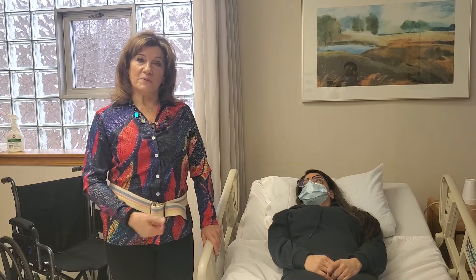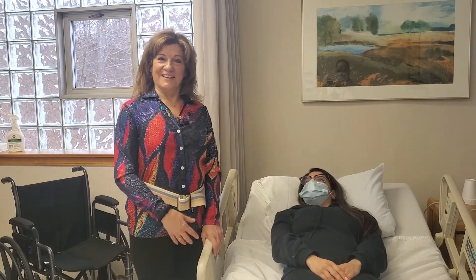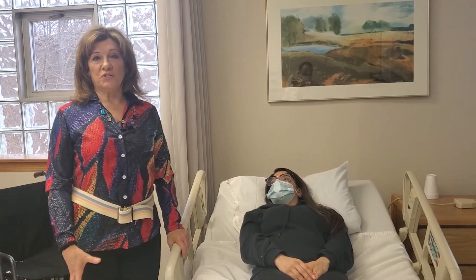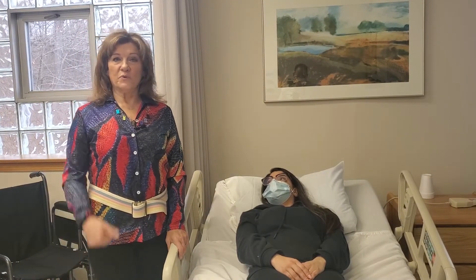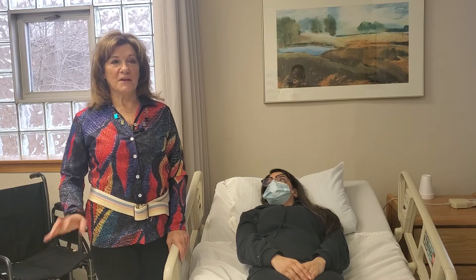We're going to be working with Cassandra — say hi, Cassandra — my sidekick here, and we're going to be getting her out of bed. Make sure you wash your hands before you start and always talk to the person. Tell them what you're going to do, ask them how they're feeling, and make sure everybody's comfortable.